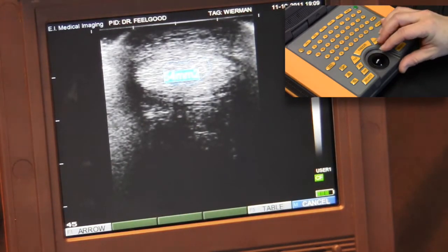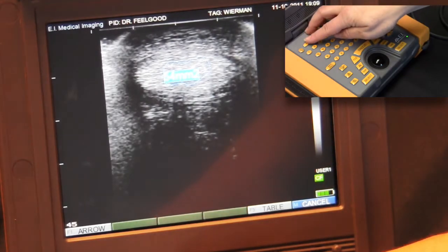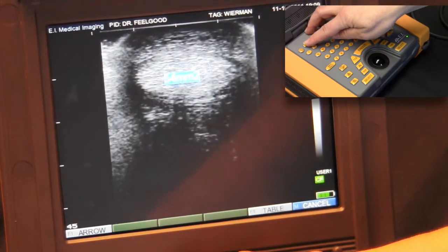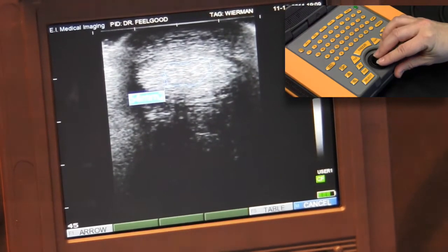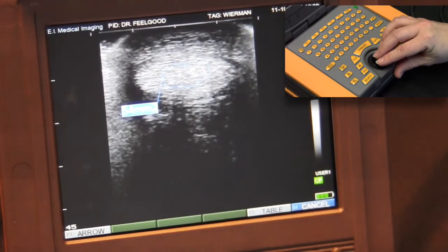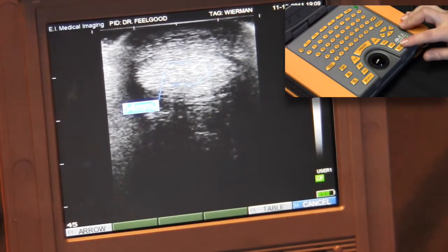By pressing the arrow key, which is F1, you can move the annotation out of the way of the structure on the screen. When the select key is depressed, the measurement is committed.